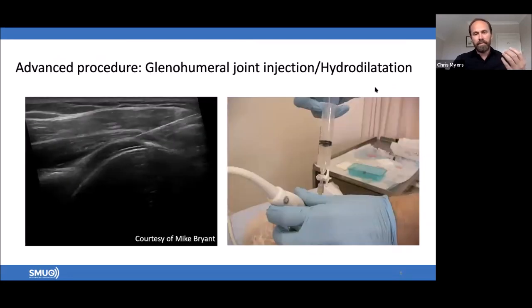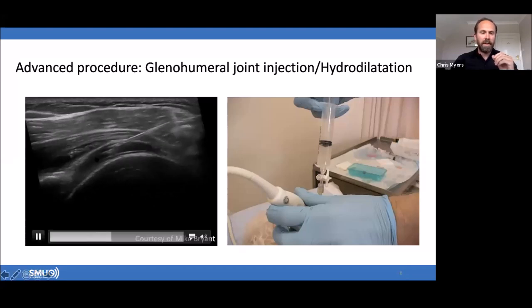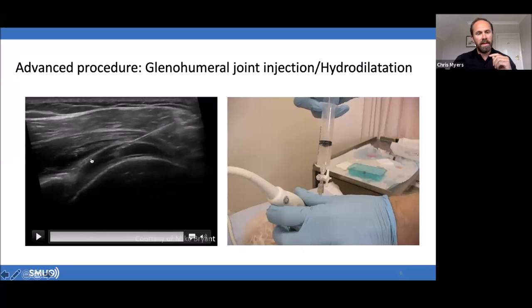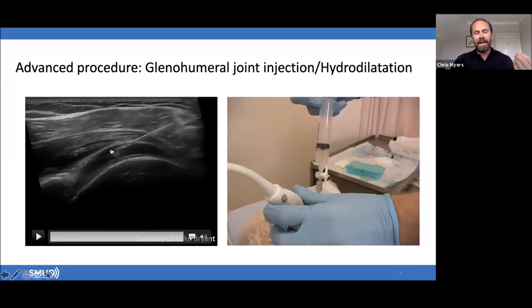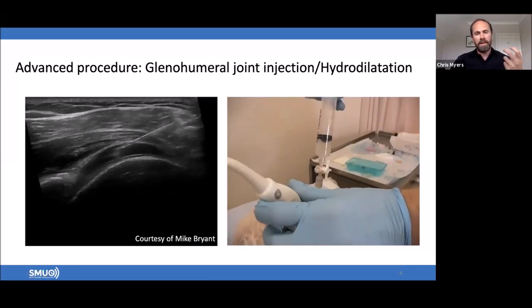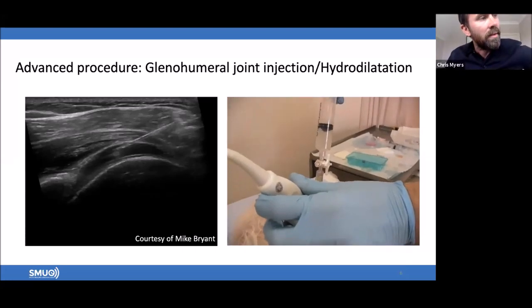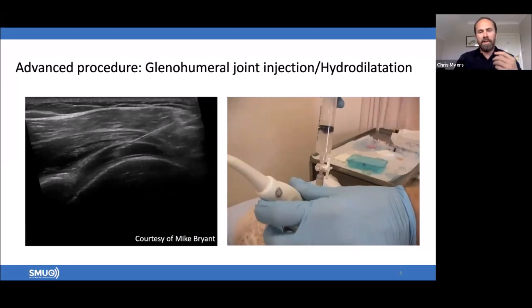the calcification. Another advanced procedure, which essentially is a normal intra-articular glenohumeral joint injection, but is a hydrodilatation. You can see here on the left, the needle coming down. This is a lateral approach, in-plane approach. This is the labrum, this is the glenoid, and this is the humerus. So you can see the lifting up. These are procedures that you just cannot do without ultrasound guidance. So it's really opened up a whole different type of injections. And certainly with the advent of things like sonosurgery, this is an area that is getting developed every year. So this is a hydrodilatation.